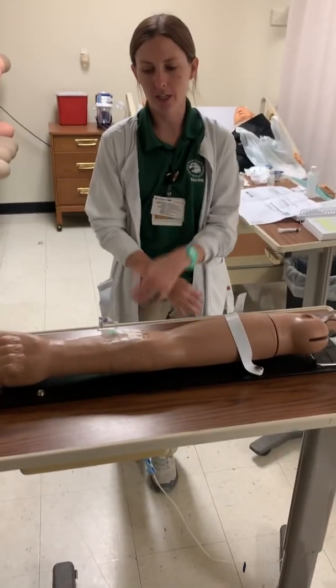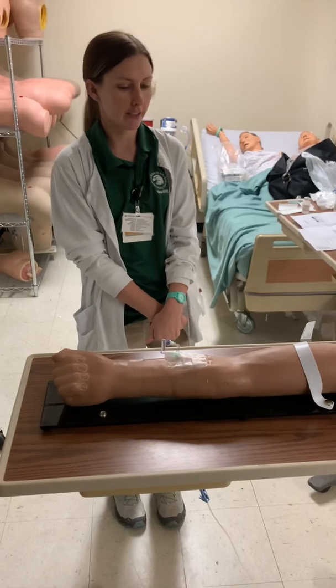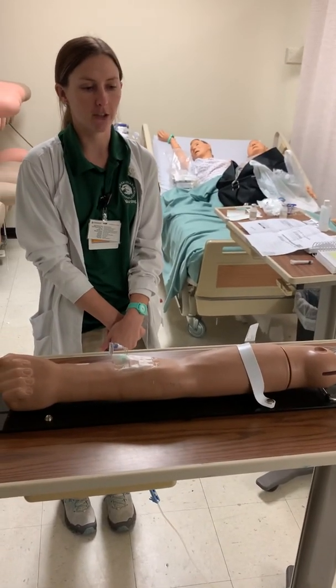So I would just visualize my patient. I would make sure that they were okay and that they didn't have any reaction to the medication, and then I would document that they handled the procedure well.